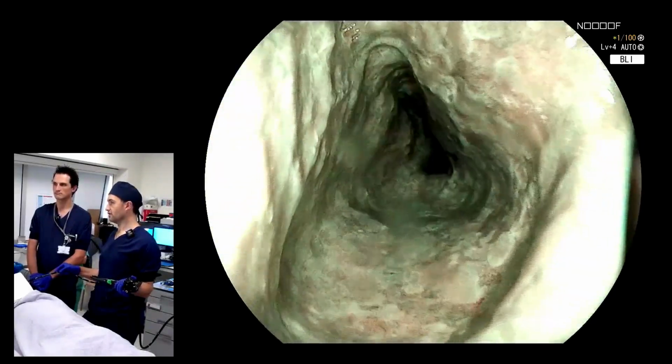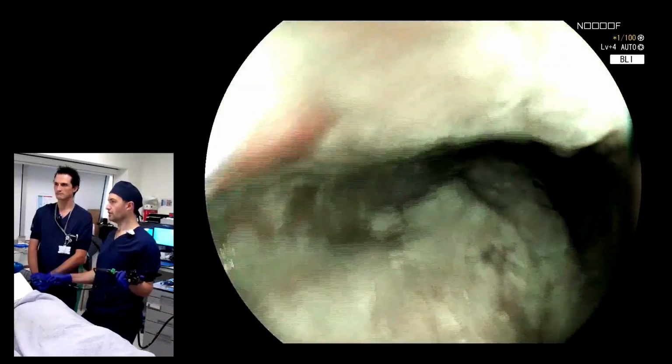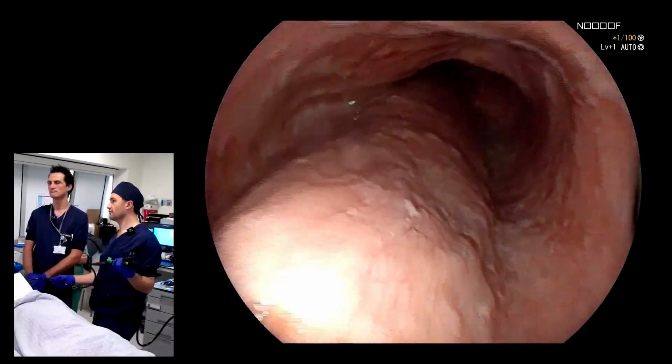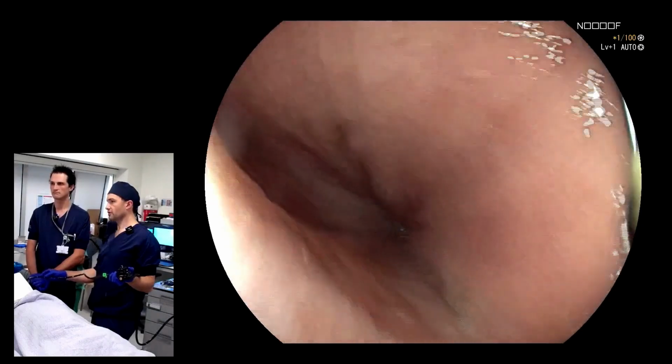And then the final aspect is the sphincter assessment, I think. So all of these things so far, the inflammation, the food stasis, all of this is surrogate features that there's some obstructive component. So you're looking for something. It could be a tumor, obviously, but it doesn't look like there's anything intraluminal anyway. Of course, we need cross-sectional imaging, but it doesn't look like we see something.